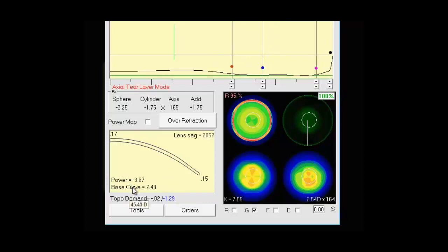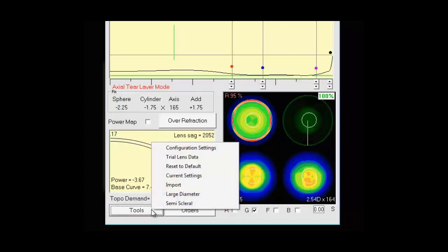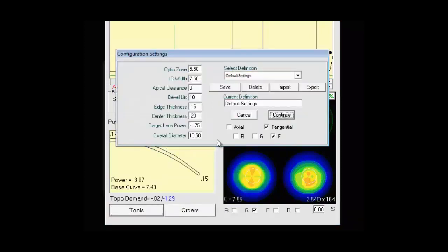The lower left we have the power and base curve. Directly underneath that we have the topo demand which is telling us the curvature of the lens in relation to the topography. Then we have our tools box. If we click on tools you'll see a lot of options here. We have configuration settings. So if we click that we have some templated designs which you can save and edit as you like. So for any specific cornea you can select the definition.